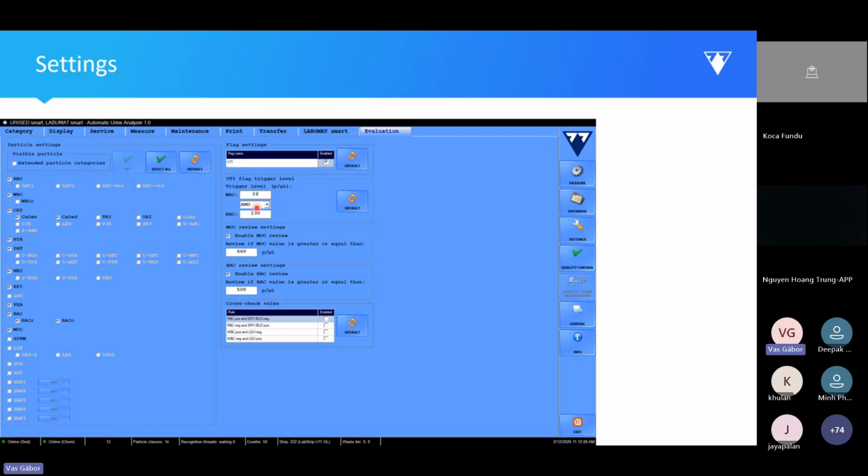You can change this and to or, so and or. How is it useful? It is useful in a way that, say you measured your first few thousand samples, you send some of these samples to microbiology to check the culture, and then you have a data set, and from that data set you can extract which were the true positive samples for microbiology culture, and which were the false positive samples that were measured, but no bacteria could be cultured.